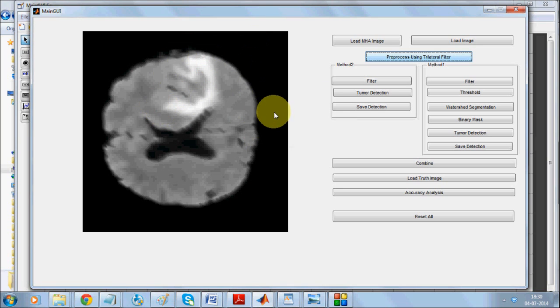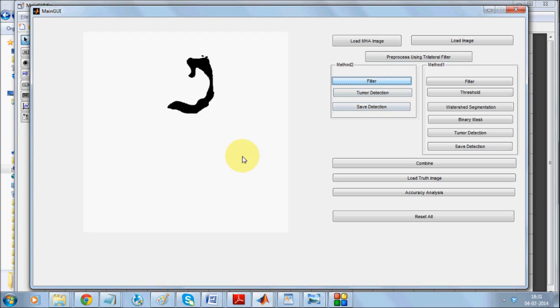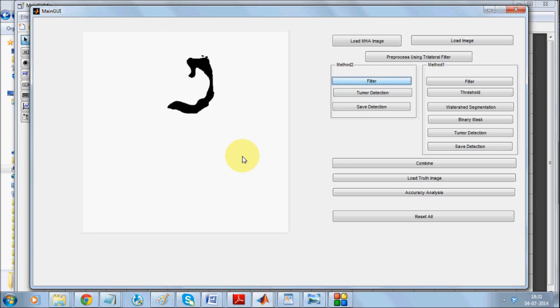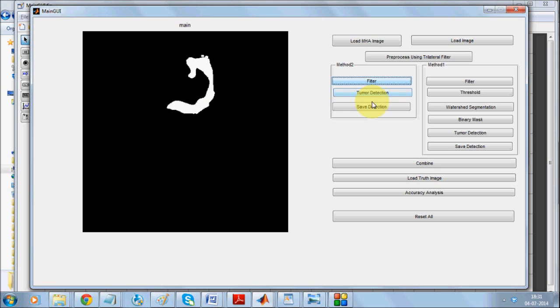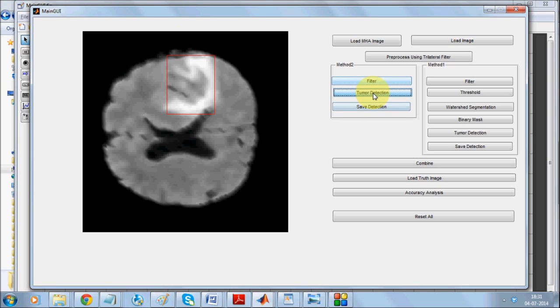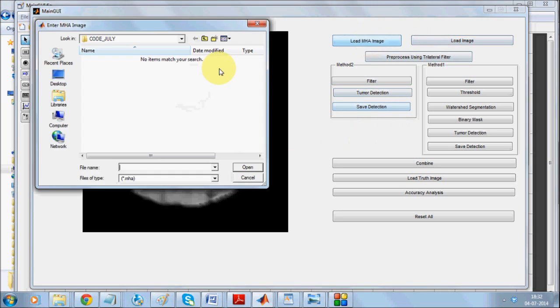We'll be going with the EM segmentation technique first. As you can see it can extract this part quite fairly. If we click on the tumor detection it can easily trap this part. We are going to save this detection result.